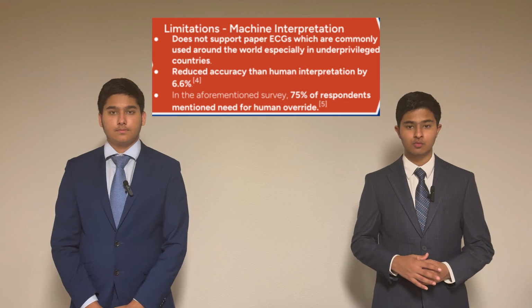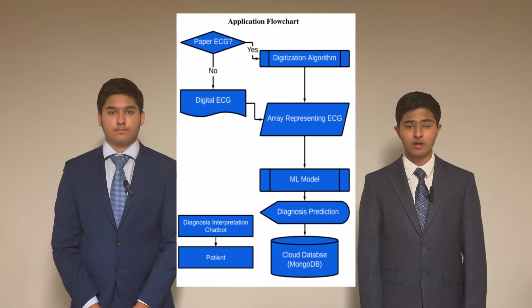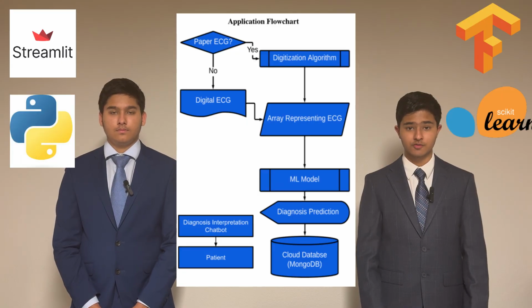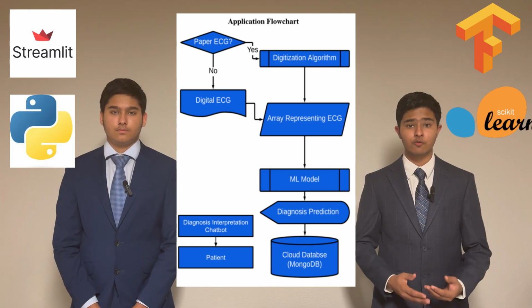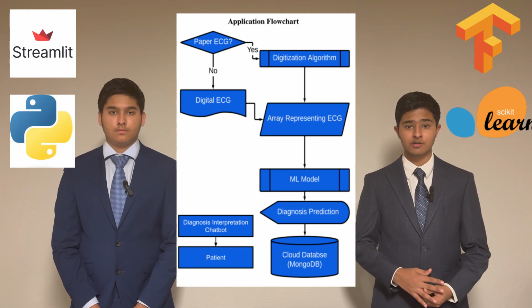To address these needs, we created SmartECG. SmartECG is a comprehensive web application developed in Python using libraries such as Streamlit and TensorFlow. SmartECG takes a paper ECG and digitizes it into a digital format, which is then run for diagnosis of diseases.